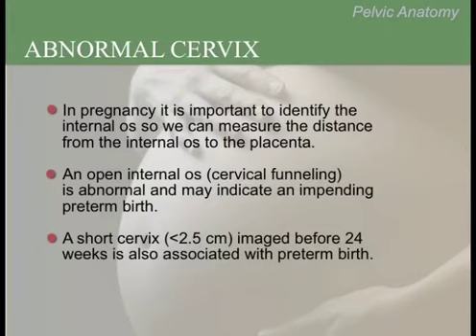You should attempt to image the cervix in every scan until late in pregnancy, because an abnormal cervix can be a warning sign of problems during delivery. Sometimes you can't see the cervix well until late in pregnancy.